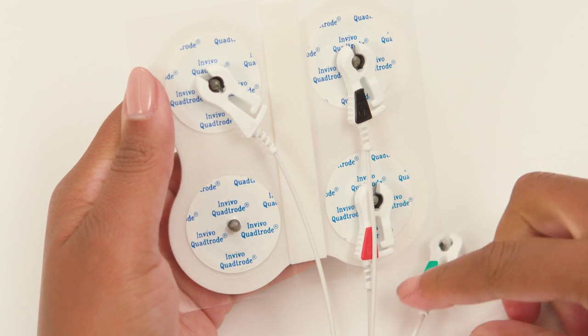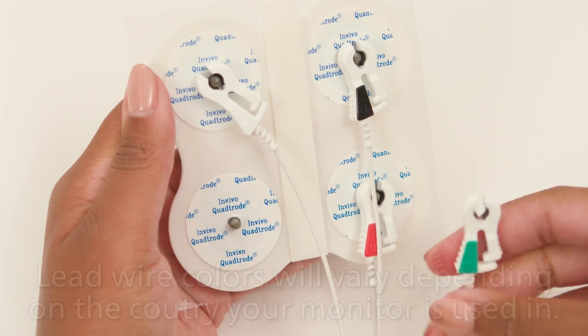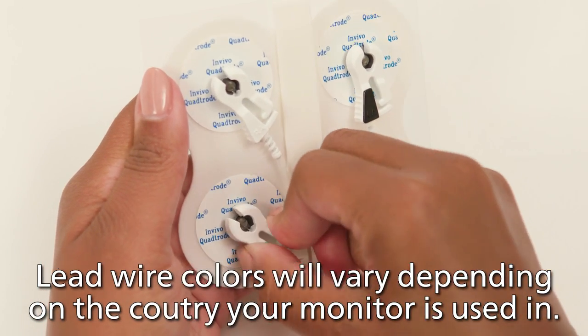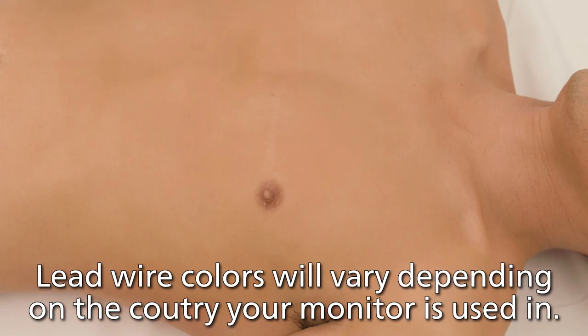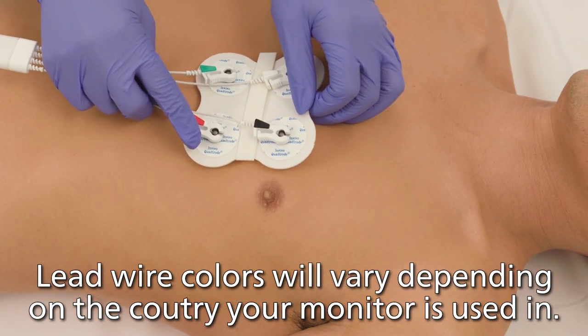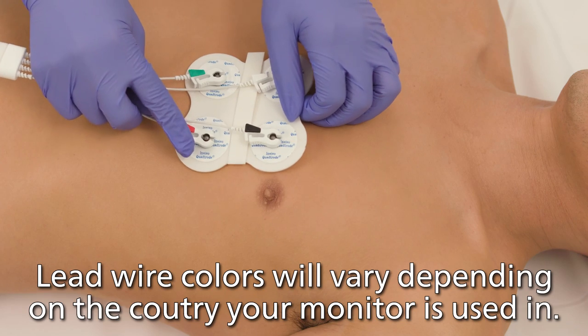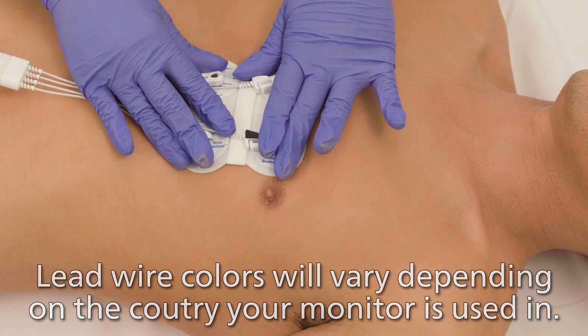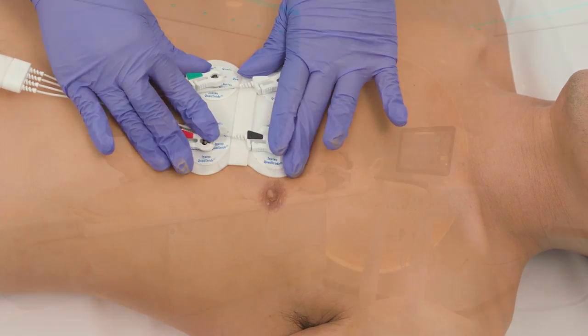Using the gating feature on the Expression MR monitor allows for simultaneous monitoring and scanning synchronization with the use of one set of electrodes, modules, and lead wires on the patient.